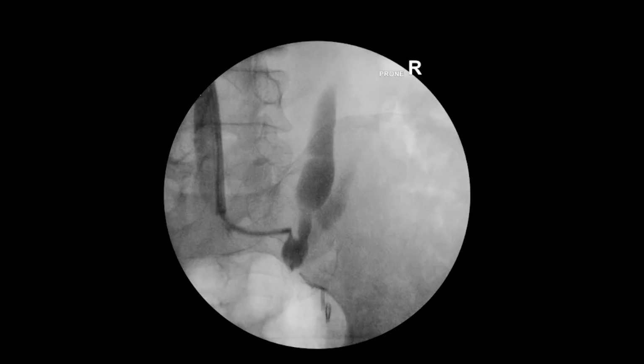We have got flow of contrast through into the conduit, but unfortunately there's a very narrow stenosed segment, which means that from the left-hand side, we're unable to access the stones which are at the plate where the ureters join in a Wallace-type fashion, the ileal conduit.